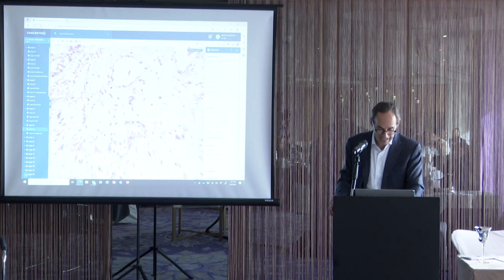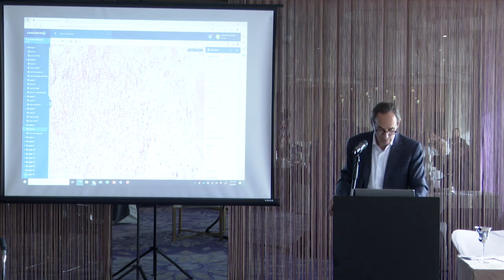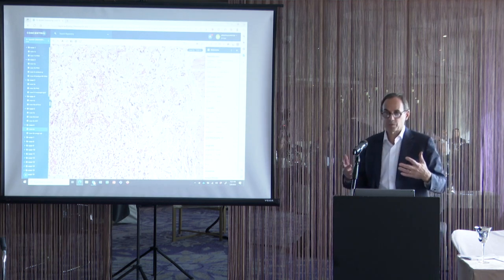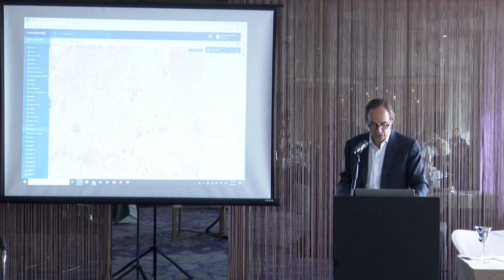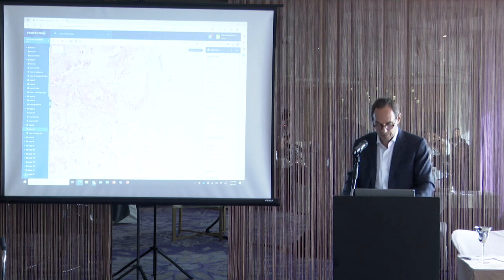You can see the amyloid tends to crack in little pieces around the vessels, which is classic. But amyloid occurs in the bladder not that rarely. This one is basically around the vessels. Sometimes amyloid can be so extensive that it infiltrates the muscularis propria and can actually weaken it. These vessels are weakened, and you can actually have a significant hematuria with the amyloid. But if you're not looking for it, if you don't think about it, you don't make the diagnosis, just like in a lot of other organs as well.